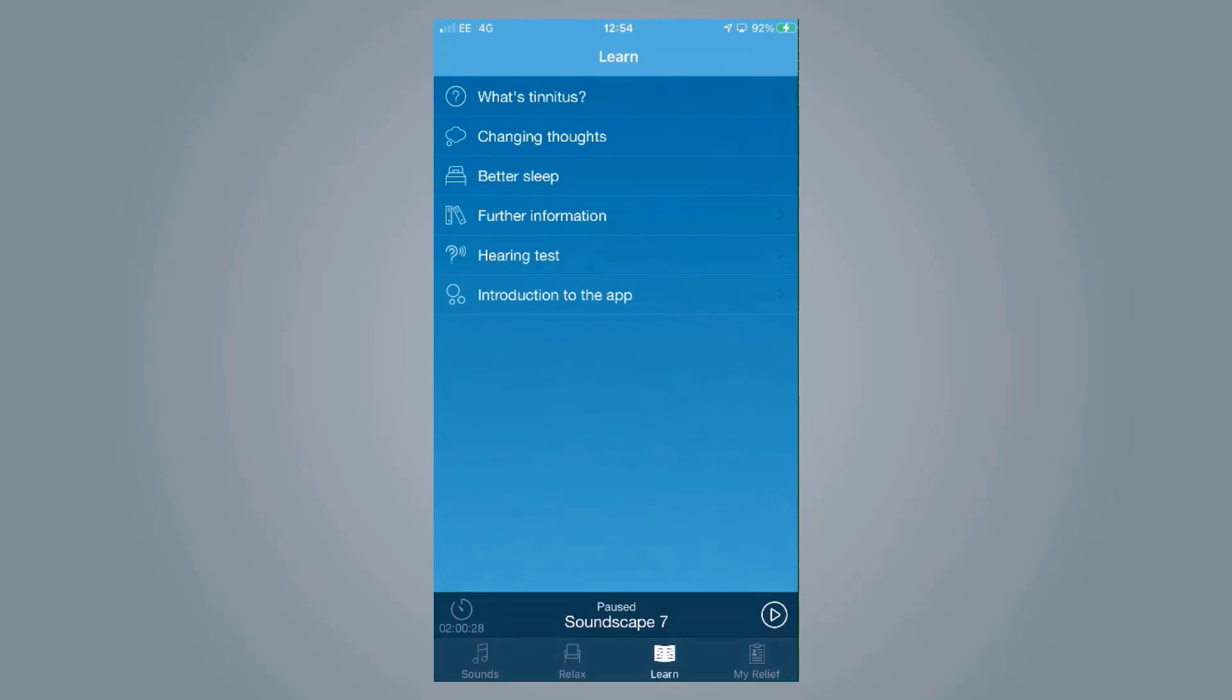We've also got a learning section which allows the person to learn about their tinnitus, learn about how to change their thoughts about it, and just give a little bit more information.